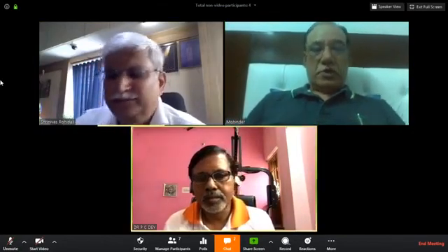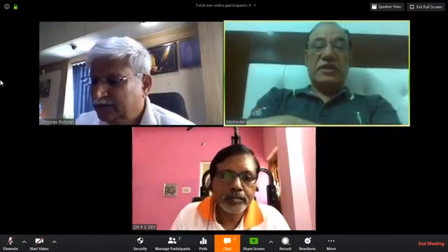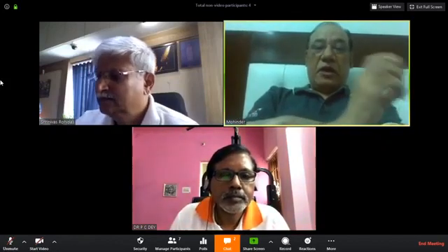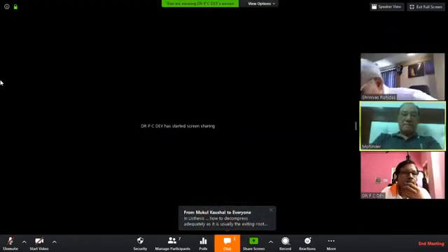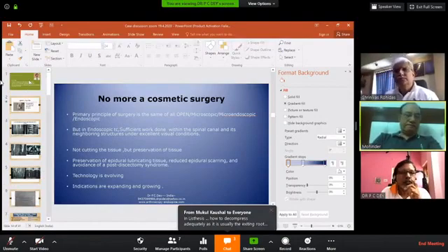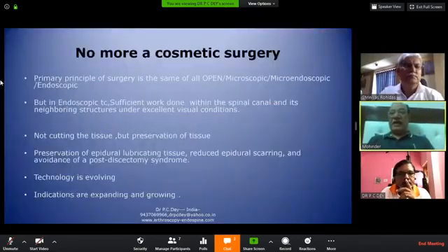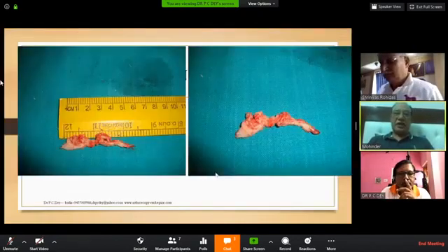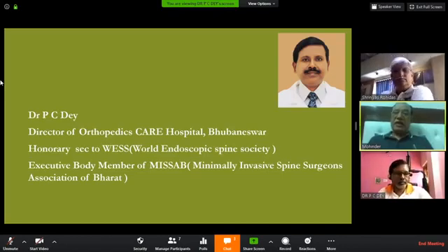As Rohidas has beautifully answered, transforaminal and interlaminar. Now, one system, all solutions or many solutions. Couple of our transforaminal guys who were using transforaminal system have become wiser of late and realize that few of the pathologies can't be addressed transforaminally. Now they are doing interlaminar procedures also and they have invested heavily. So in one go, if you want to save on economy, you learn and master one technique, interlaminar technique, and it addresses all the issues. So this is what I want to tell.